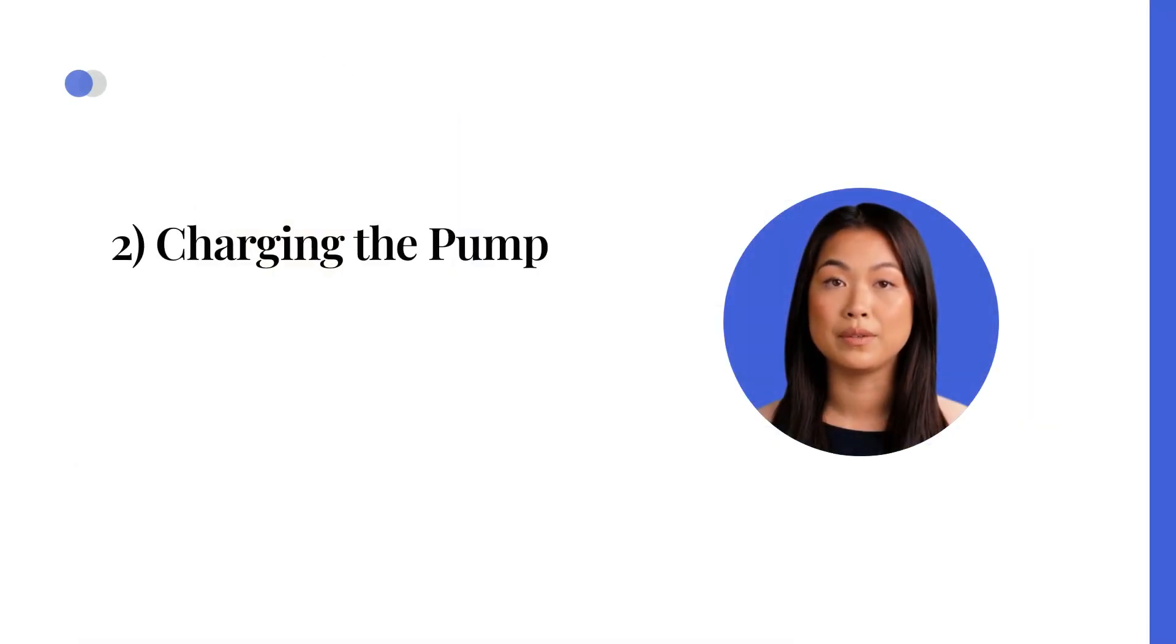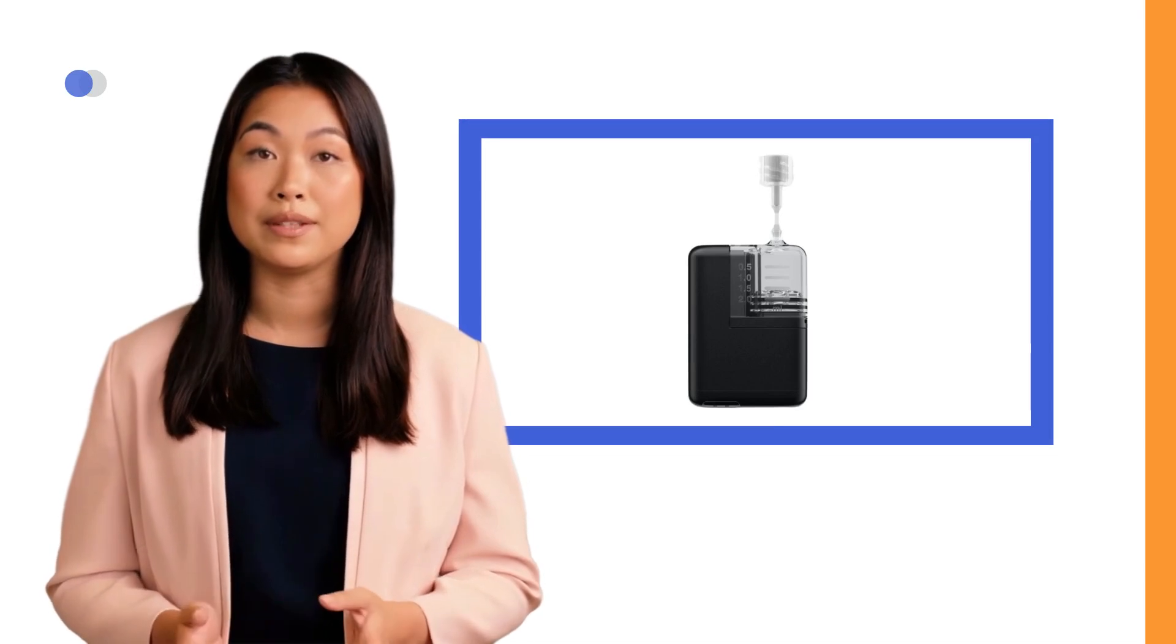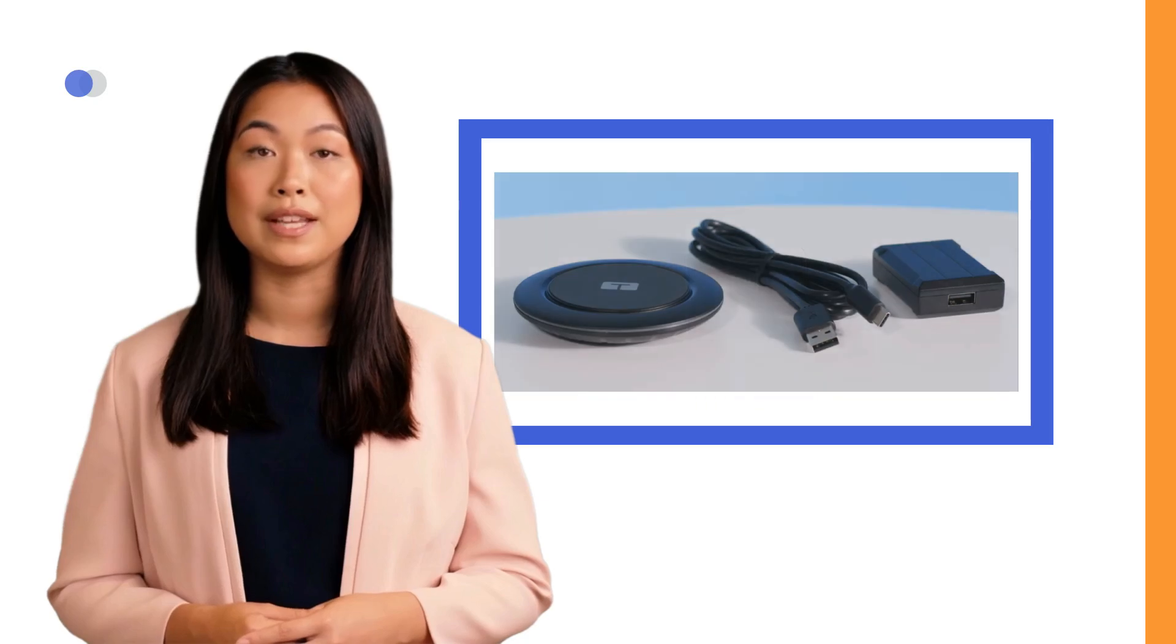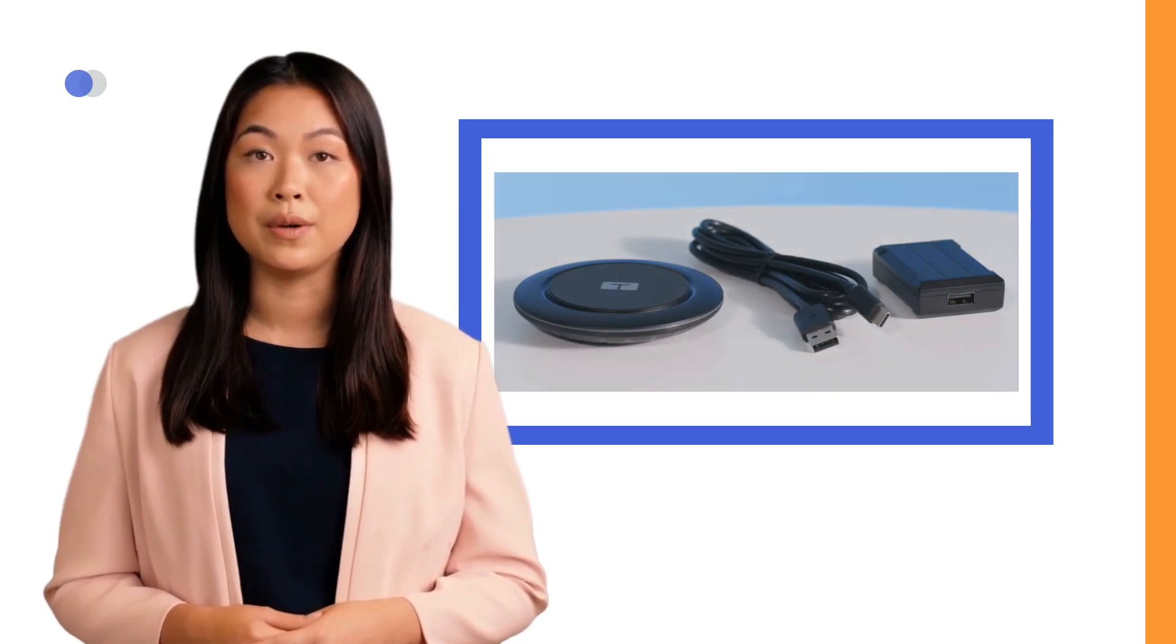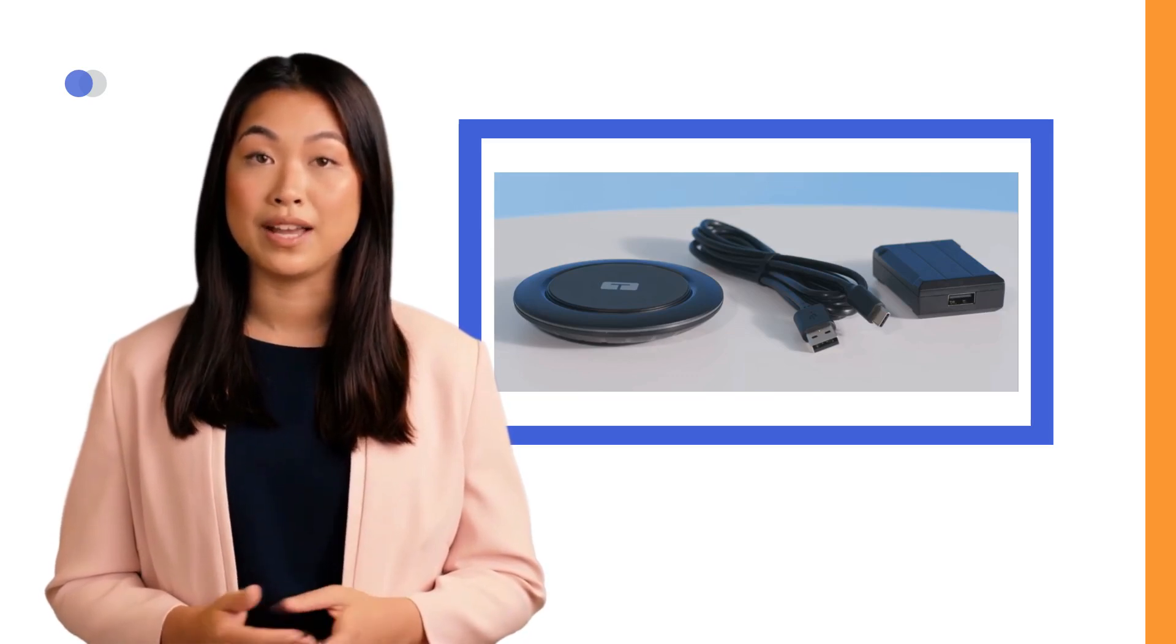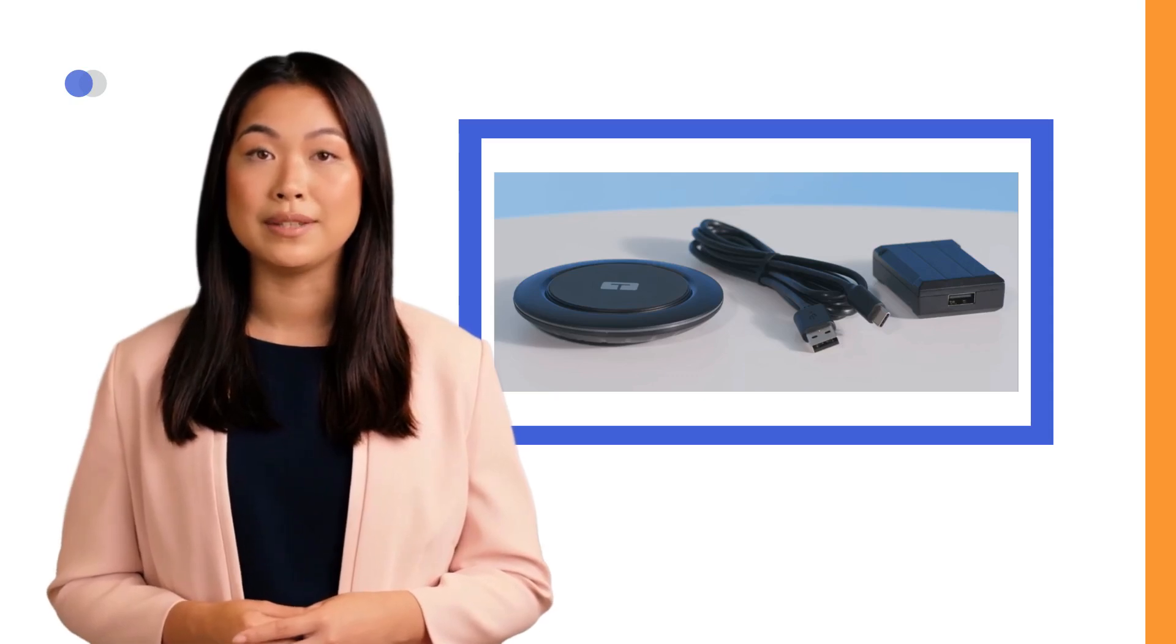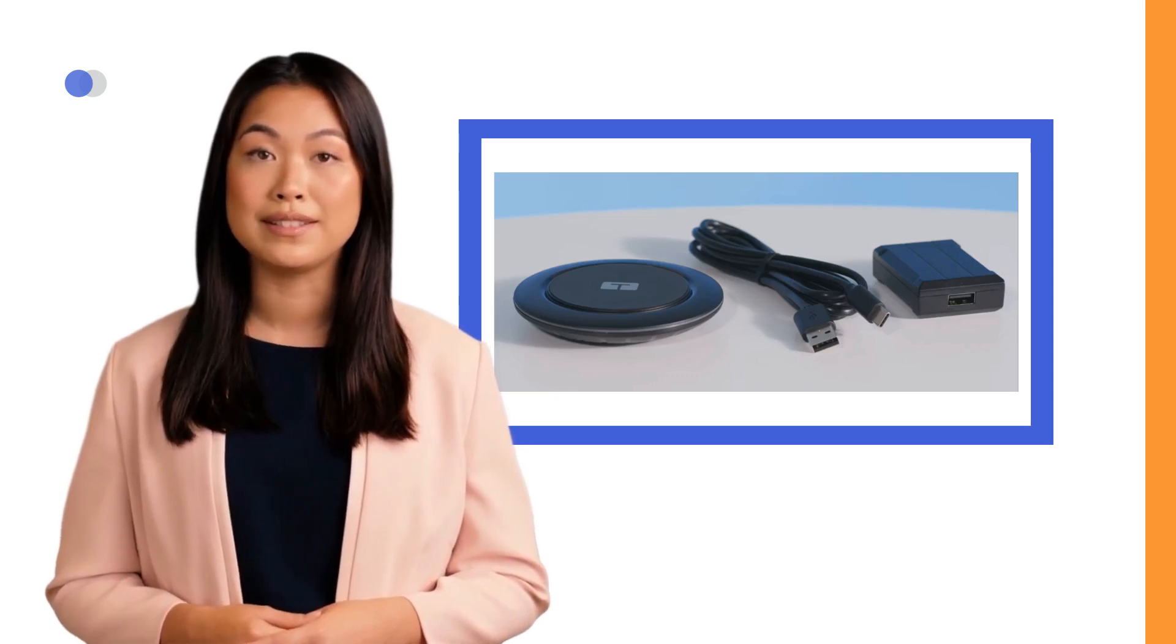Charging the pump. When you receive the pump, you'll need to charge it first. The Tandem Mobi pump does not have a charging port. Instead, it comes with an inductive charging pad that connects to a power source using a USB to USB-C cable. It also includes accessories for charging from a wall outlet. You should only use accessories that have been provided by Tandem Diabetes Care and we don't recommend using adapters or extension cords.